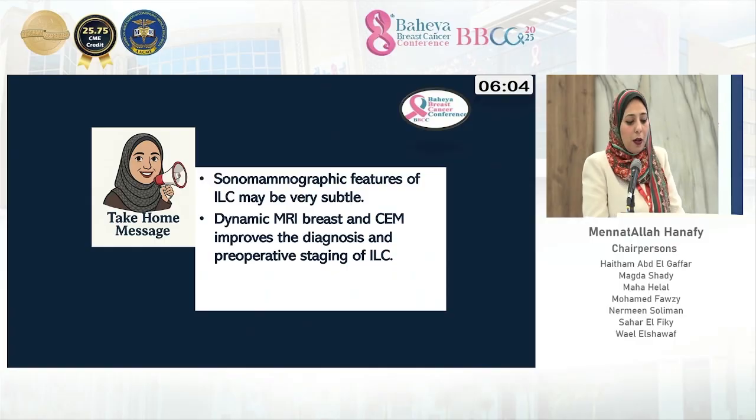So our take-home message in this case, sonomammographic features may be very subtle. Dynamic MRI breast and contrast-enhanced mammography improved diagnosis and preoperative staging.